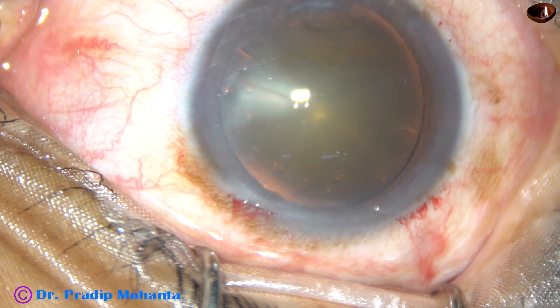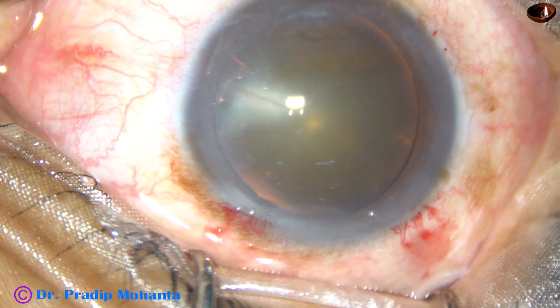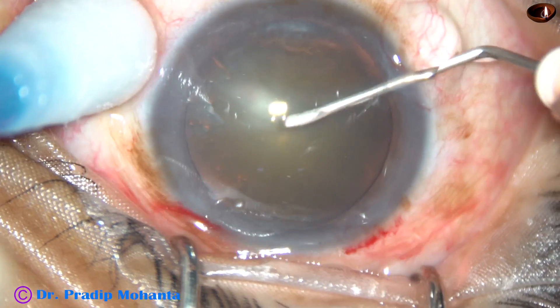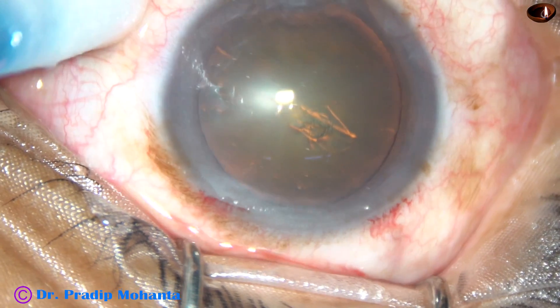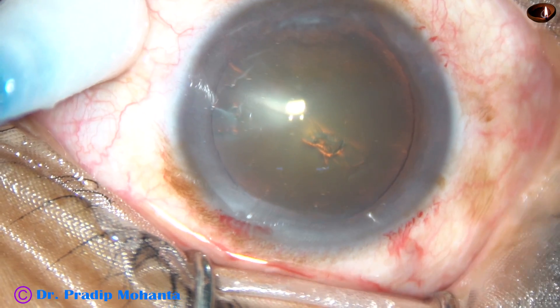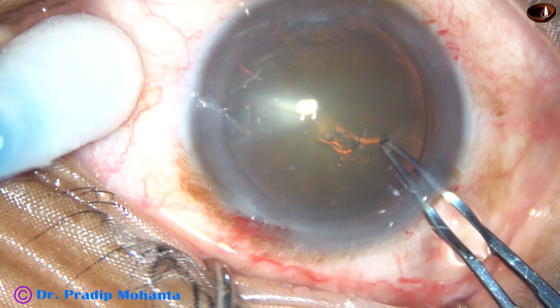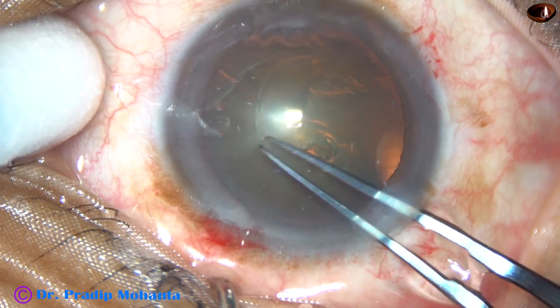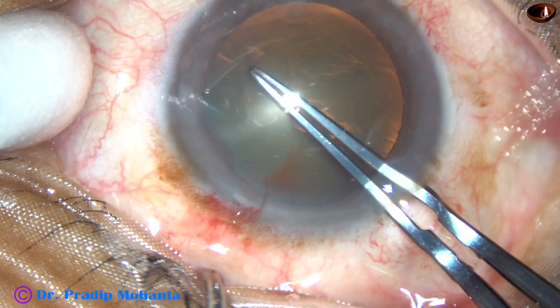These side ports should be two and a half to three clock hours away from the main incision. In this case, the incision on the left side of the main incision is about two clock hours away, and the incision on the right side is about two and a half to three clock hours away.